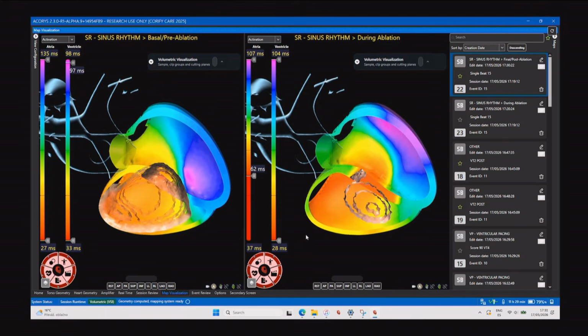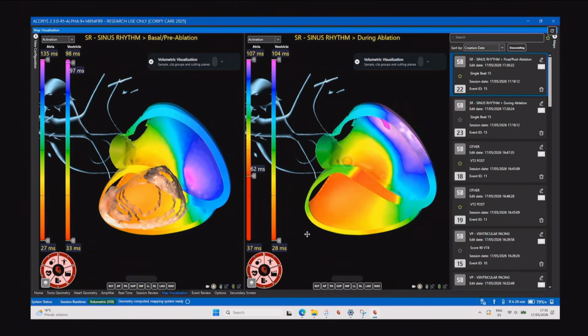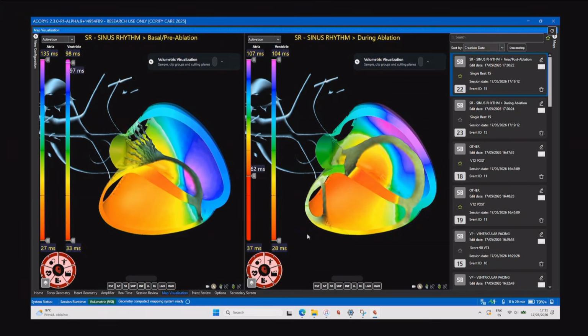It's because it's the last one. I think now it's late, but it's not delayed. So it's late because it's the lateral basal part. Yes, exactly. But there is no this kind of delay.